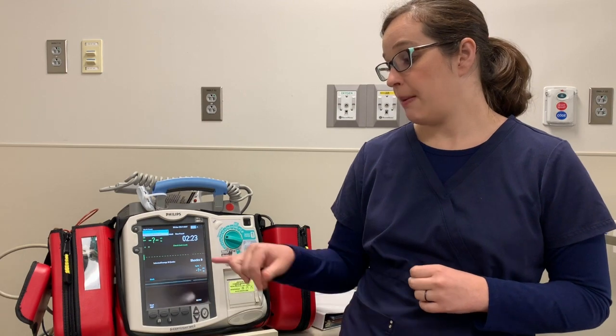For synchronized cardioversion, your patient is only half dead, so you're going to use half the Joules. We do 0.5 to one Joules per kilo to start with, and you can go up from there. If you're having to go up too high and your patient is alert, please make sure to consider sedation.